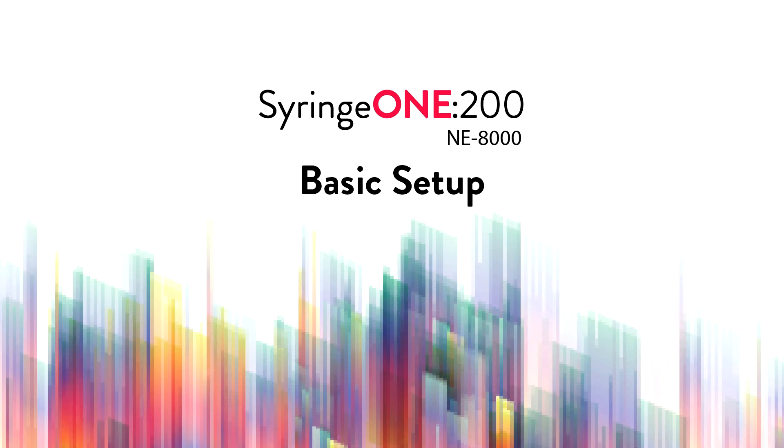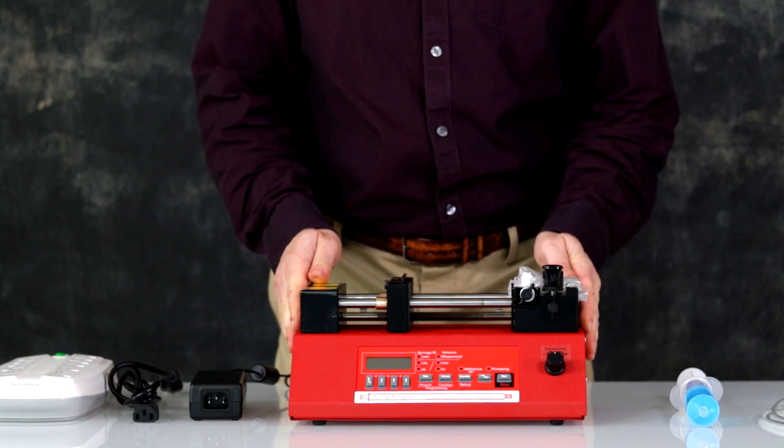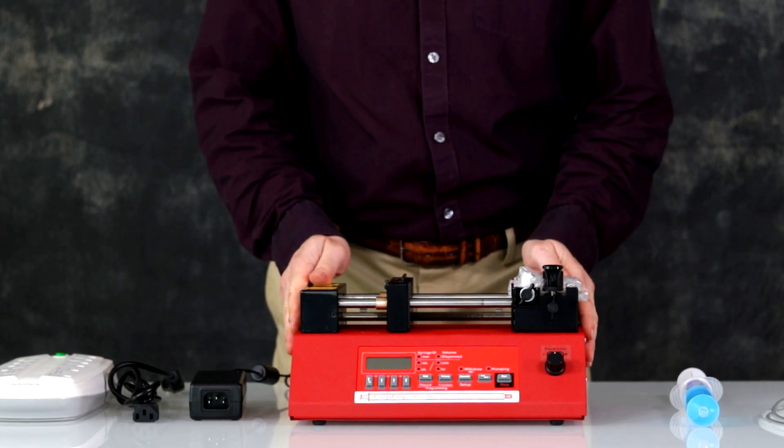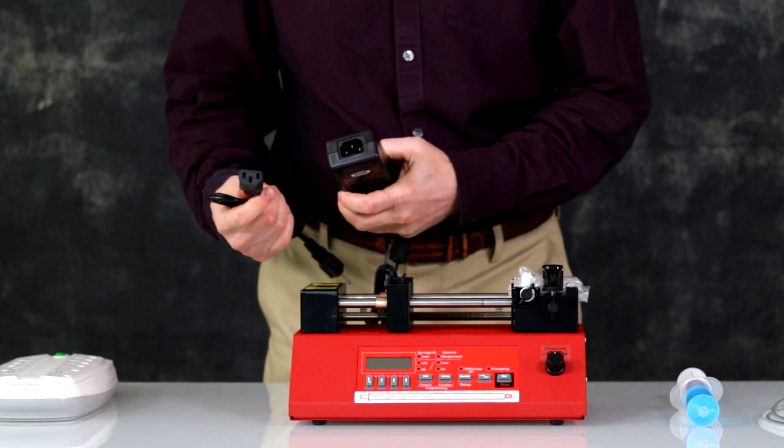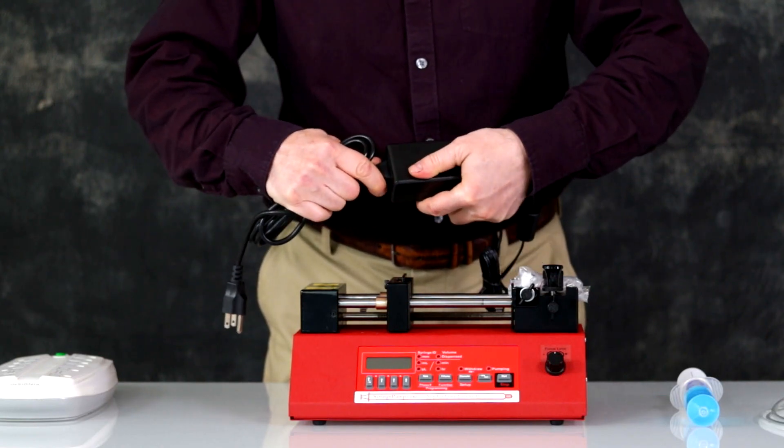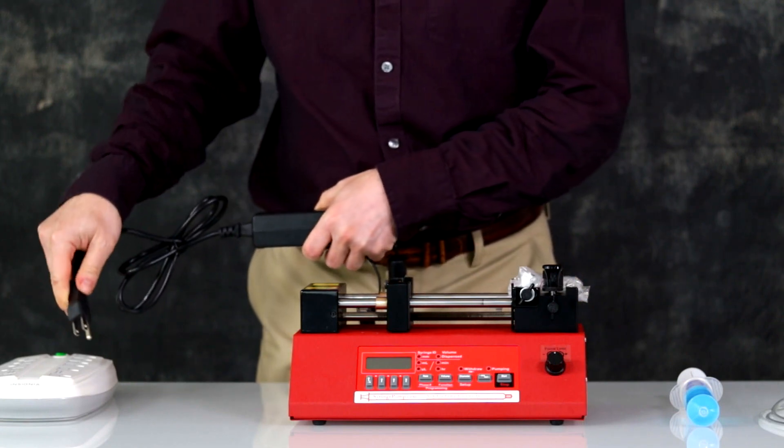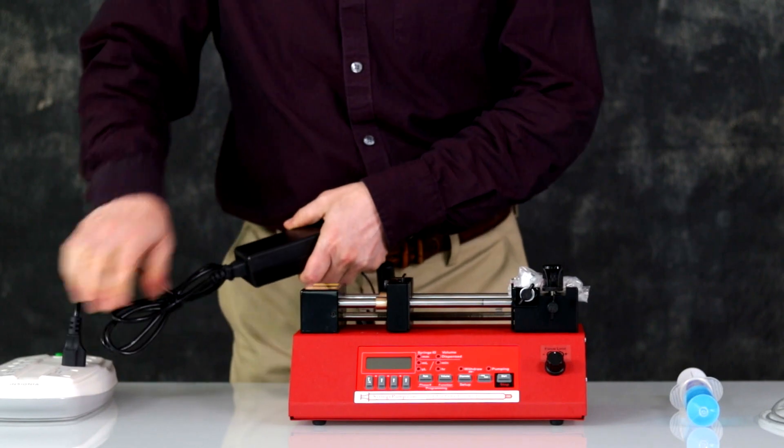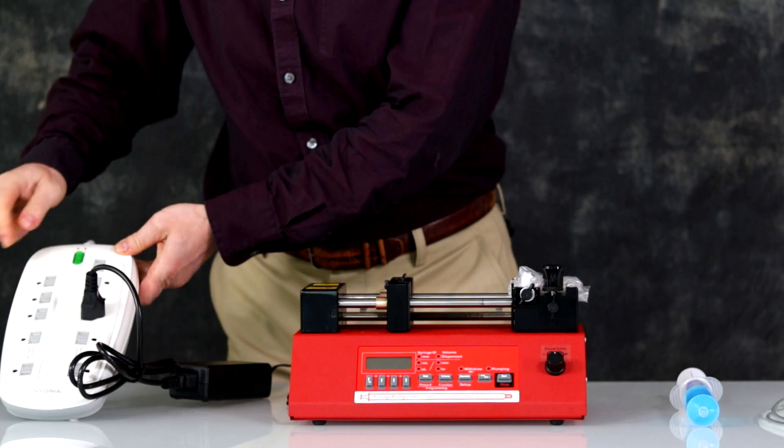NE-8000 basic setup for syringe pumps 1-200. Begin by plugging your power supply into wall power or a power strip. If you are using a power strip, make sure the power strip is turned on.